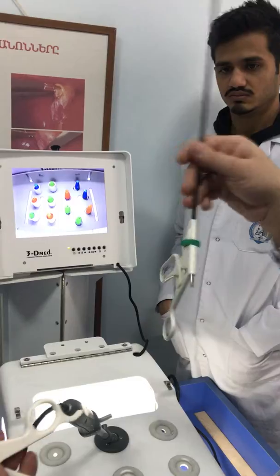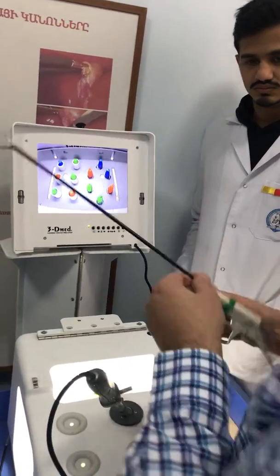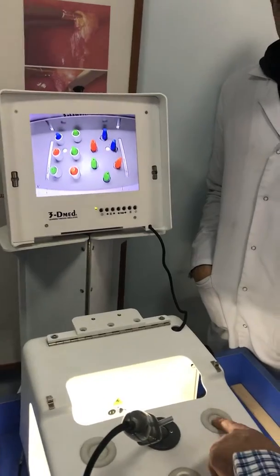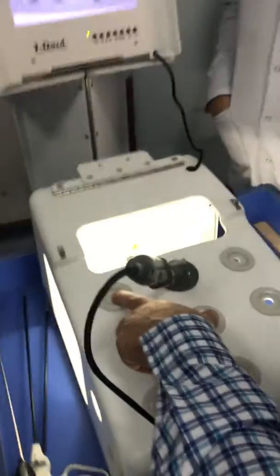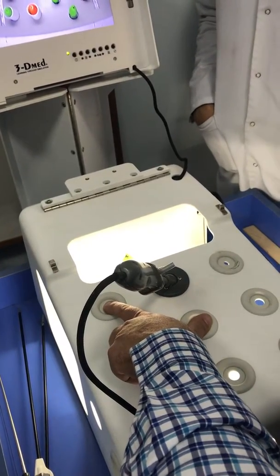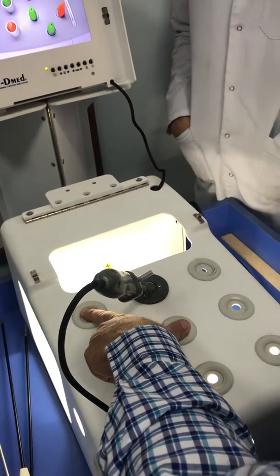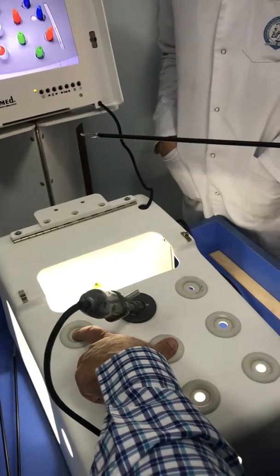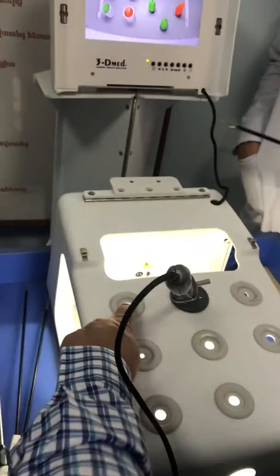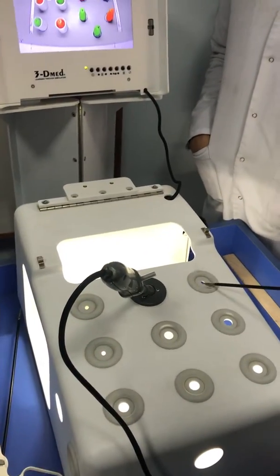We take dissector. And here, you used only this hole or this hole? Right hand. For left hand. But we must make with your hand. Right or left? We have a left hand. You use this hole. Here?